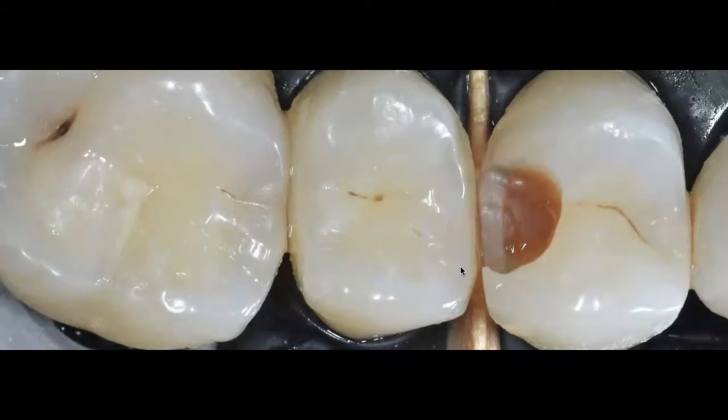But at the same time, when I'm looking at this cavity, I can see the infected dentin. I can see that brownish, soft, leathery type of dentin that has now been exposed, and that I am ready on my next step to initiate removal. And again, one important aspect of having good access is that once you remove that proximal wall, you always end up with these straight walls of enamel.